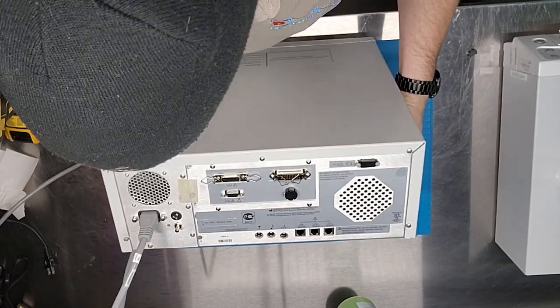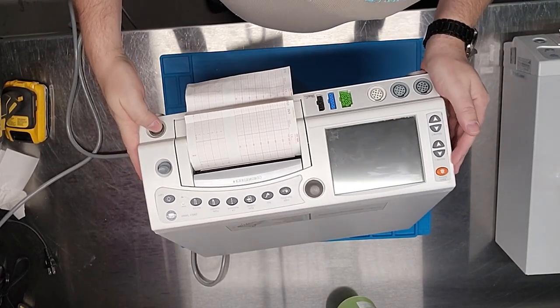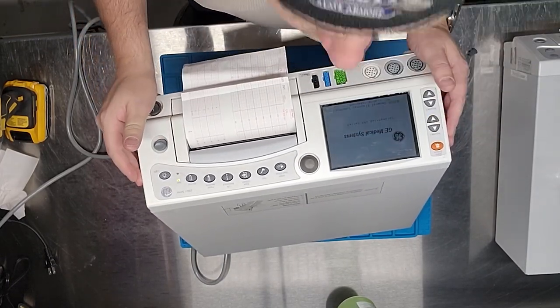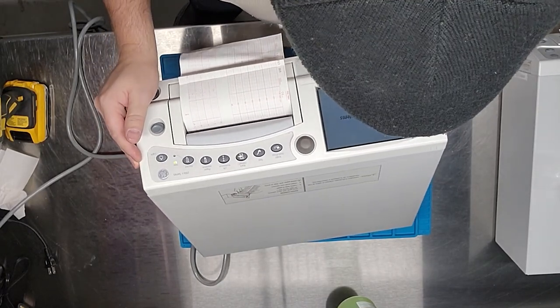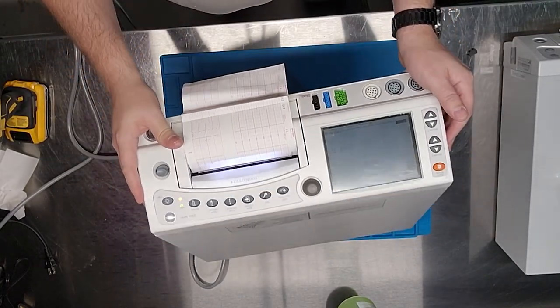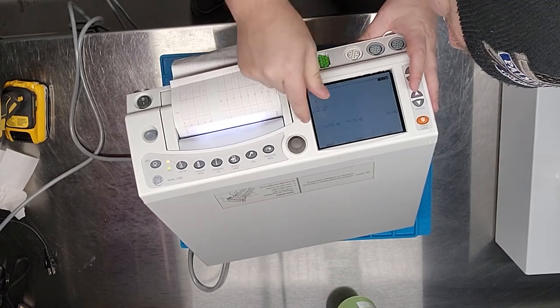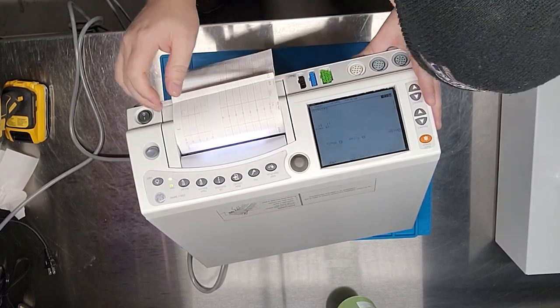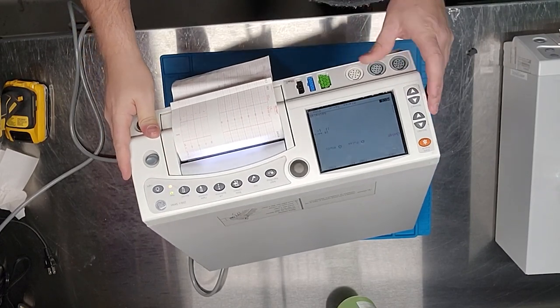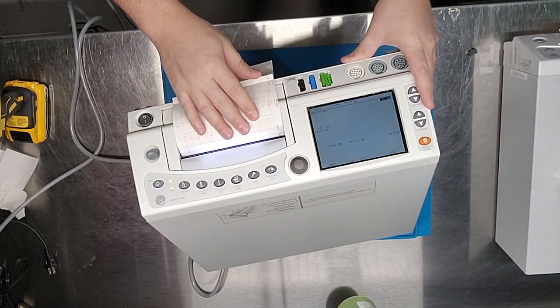Let's power it up. It tests the power supply first — amber, then green — and then we have the display. The core metrics display is a little dim; as they get older some backlights start to go out, making it harder to distinguish colors. Down here is the maternal ECG, and there's also fetal ECG which you can select. Once it boots up you can see the printer is moving, very slowly.